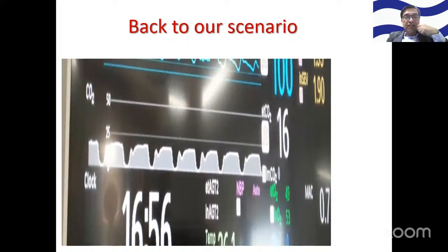So back to our scenario where we got this leak, we saw this kind of notch which is coming quite early, and it is quite constant. The time was quite constant, right? And it was coming quite early. But this was not a transplant patient, and this was not a kyphoscoliotic patient, and this doesn't look like a curare cleft to me, right? So what could be the scenario?